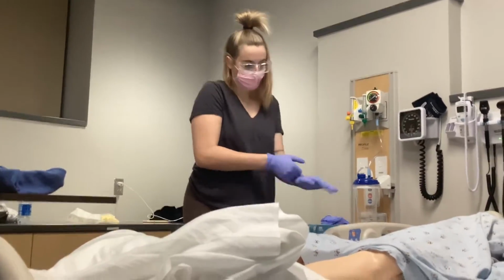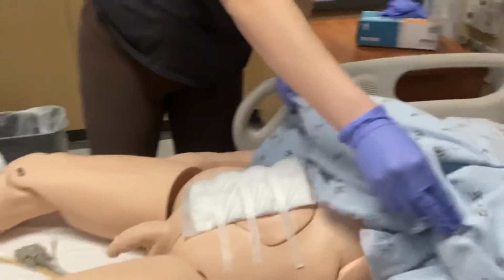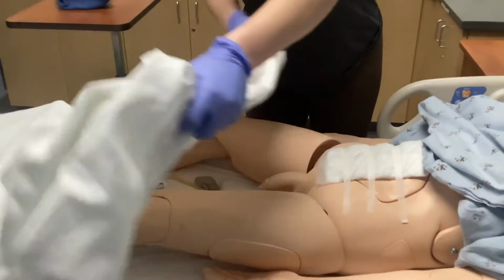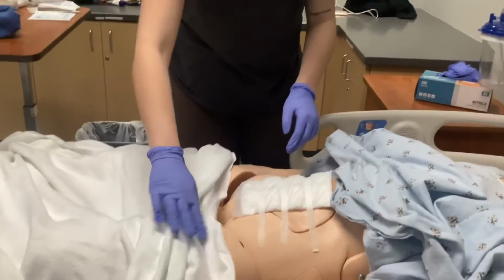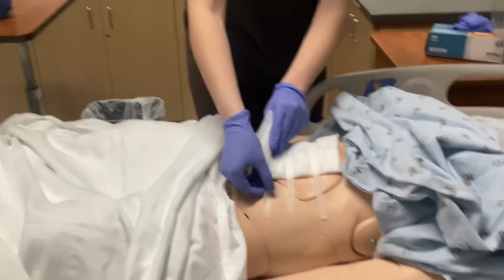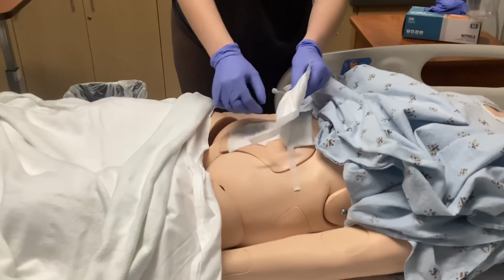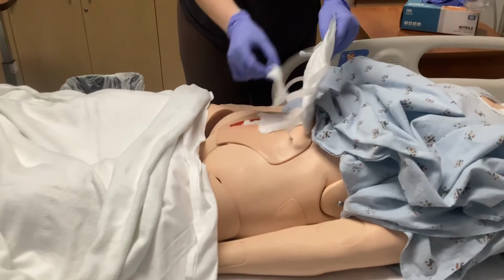All right, Mr. Jones, I'm going to go ahead and pull up that gown. This time I'll bring the blankets back up to provide privacy. All right, Mr. Jones, this may be a little bit painful. Keep breathing. When I'm removing the dressing, I'll be removing it one layer at a time, pulling it toward the patient so it blocks the wound and any foul odors.